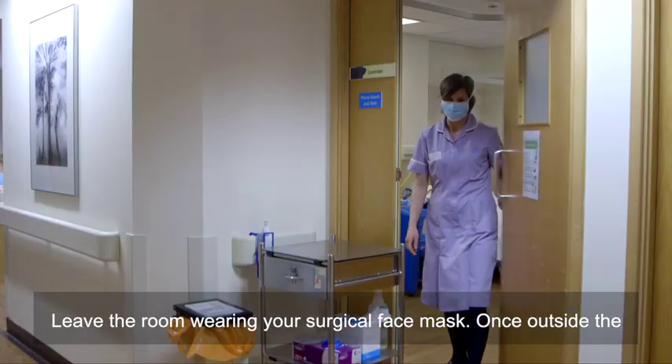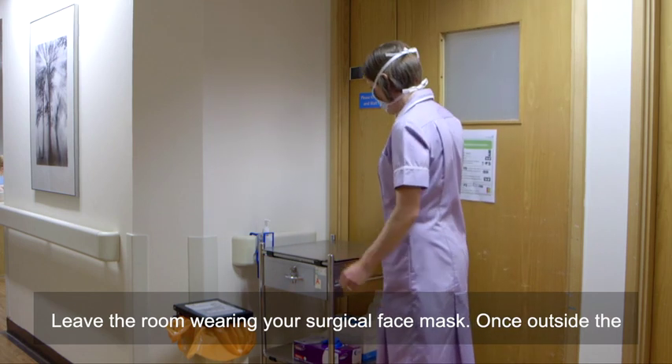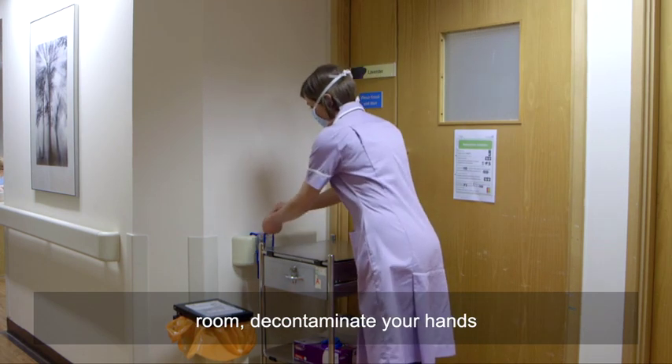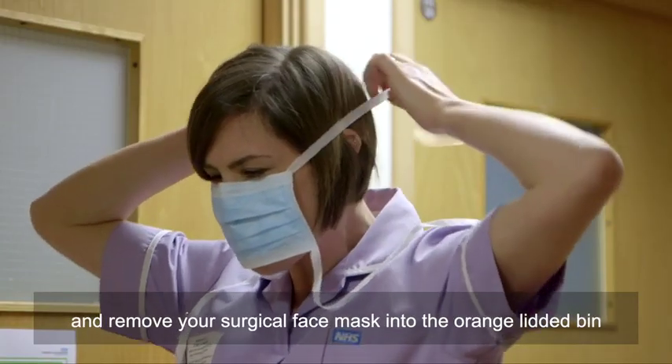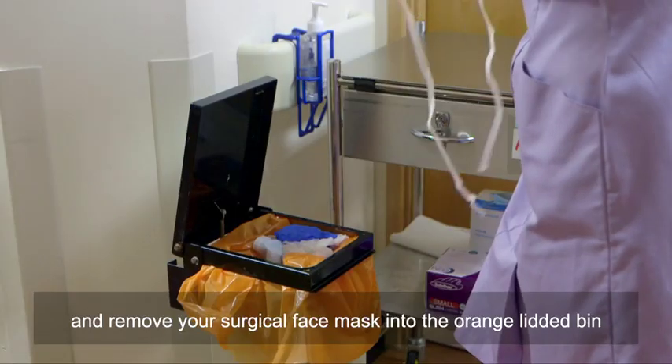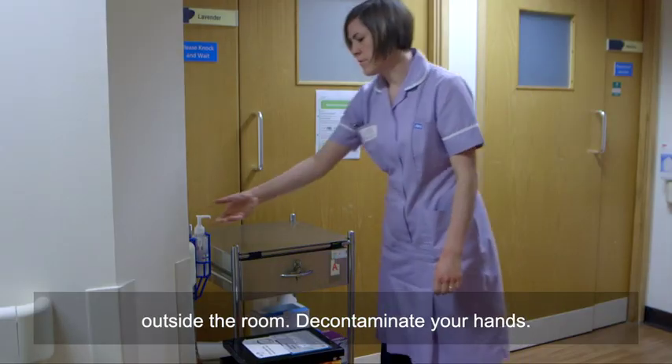Leave the room wearing your surgical face mask. Once outside the room, decontaminate your hands and remove your surgical face mask into the orange lidded bin outside the room. Decontaminate your hands.